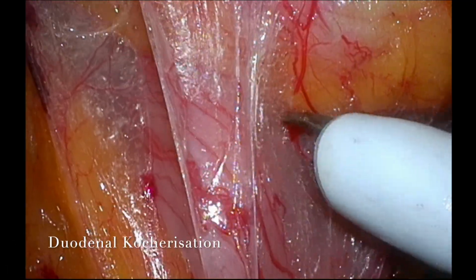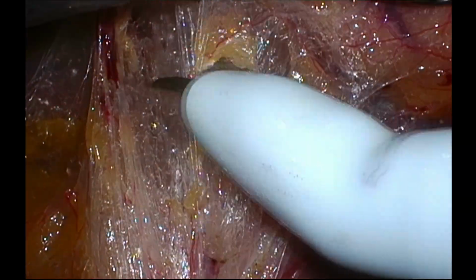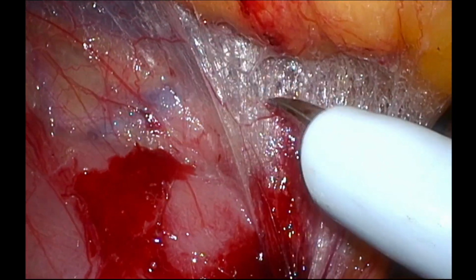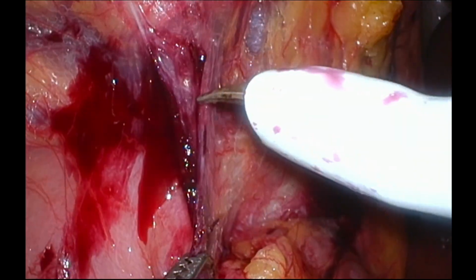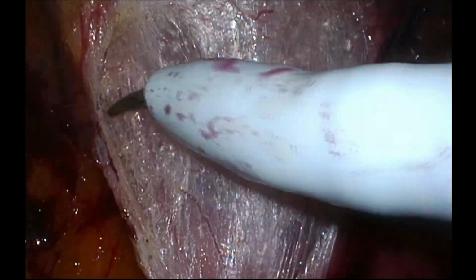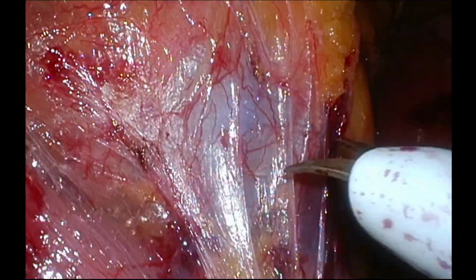Following adequate colon mobilization, duodenum is kocherized. Duodenal kocherization is required only for the right side. Duodenum should be kocherized adequately so that inferior vena cava is visible.